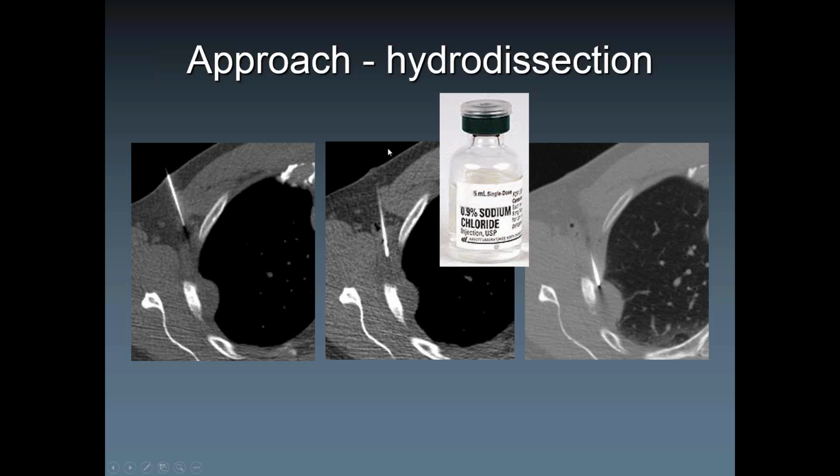Tandem technique means you get closer with the spine needle, and then you follow with the introducer at the same time or in the next shot. And once you're getting close, you inject saline through the spine needle, because there's less saline lost and wasted than in the introducer. It's a smaller gauge needle. You create the lump, and then you advance the needle to the target or close to the target. That's a pretty safe and well-published technique.